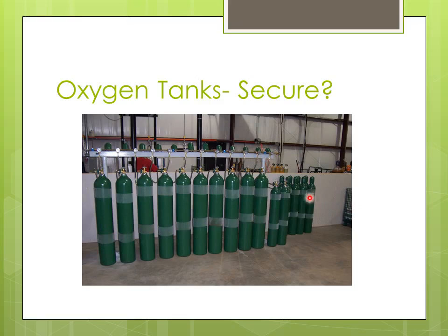In fact, over here you see similar. They're kind of like bowling pins, but there's nothing holding them. This would be a clear issue, having these cylinders just standing on their own like that, and it could be quite dangerous. We hate to think what would happen if one of these cylinders were to fall over and crack its valve. It could almost be catastrophic, to be honest with you.